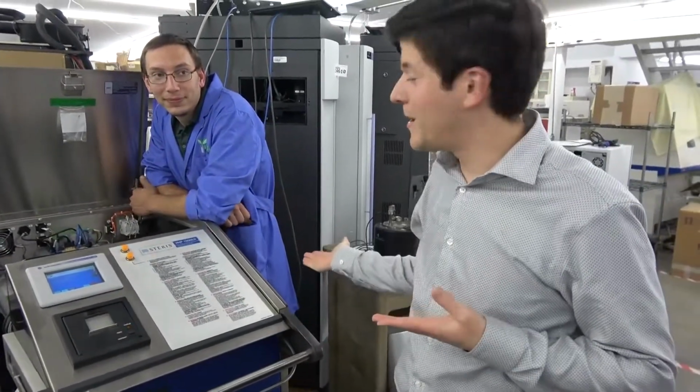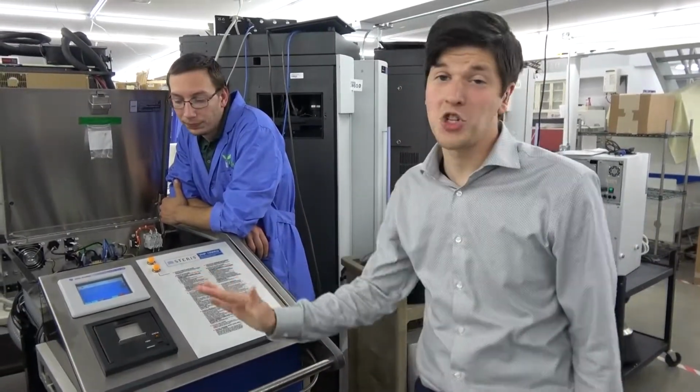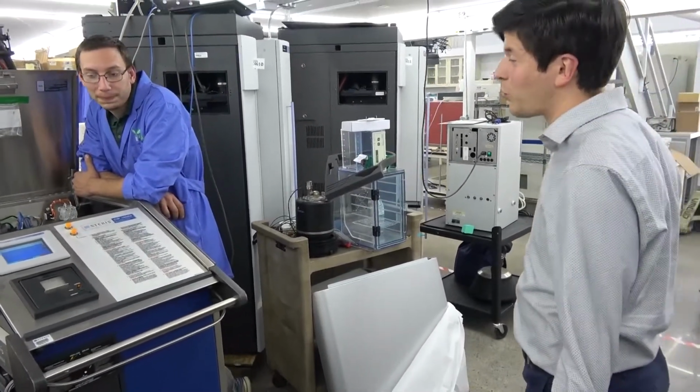Inside of a VHP system, there's a scale. It's Mettler. That's cool. That's a good unit. It's not one of the older ones because some of them had janky looking controls. And really bad keypads. So the worst of both worlds.